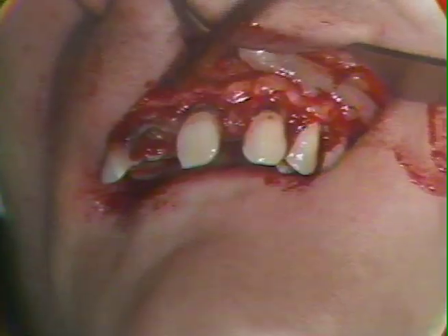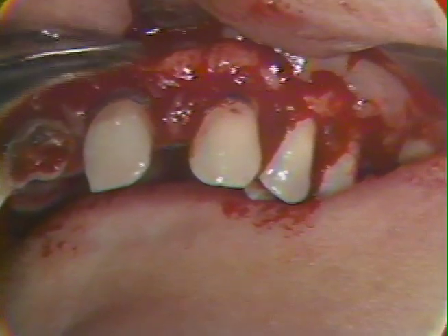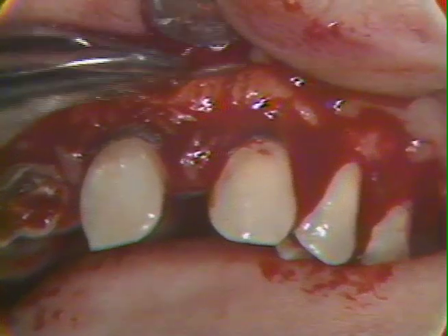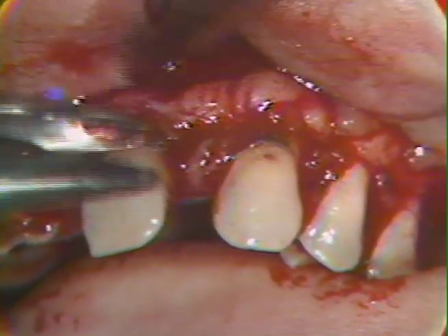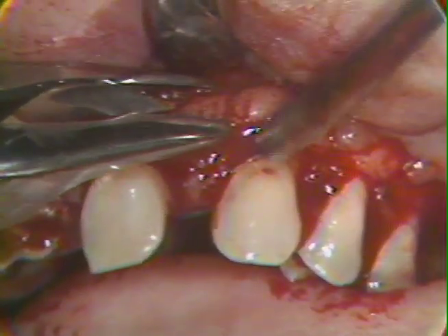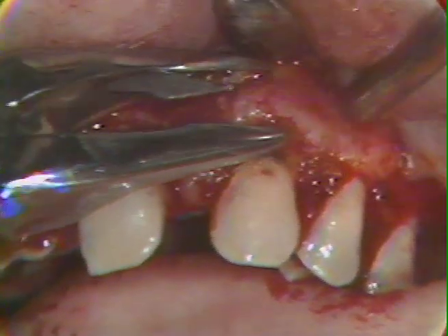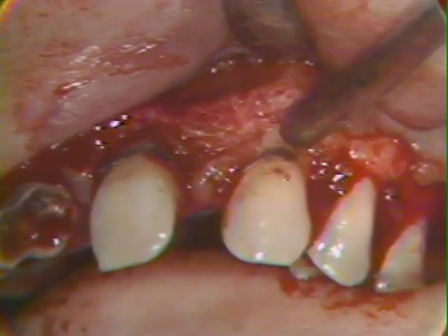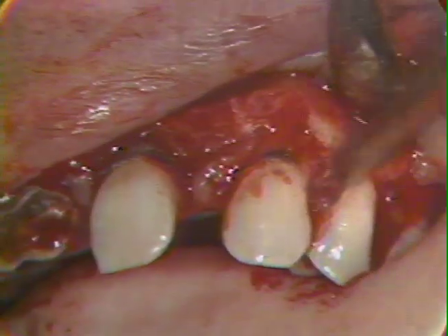The flap has been reflected over these remaining teeth, and we see once again a lot of hidden irregularity in these bony contours. Suction, please, right here. You can see the great concavity and this rather sharp spur that is there. Once again, we're going to give that a little bit of pre-extraction contouring in order to avoid some of the resistance to the delivery of those teeth.